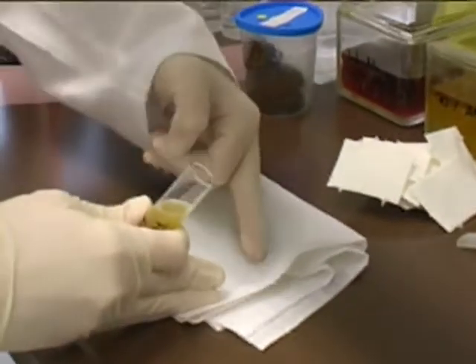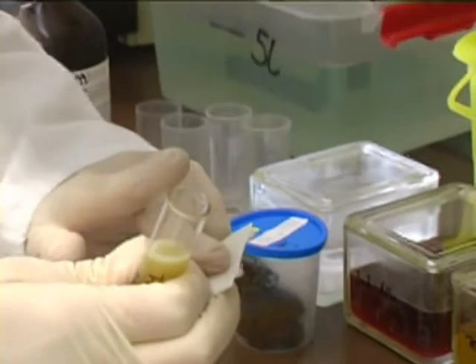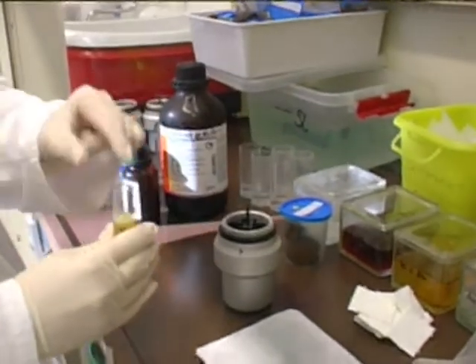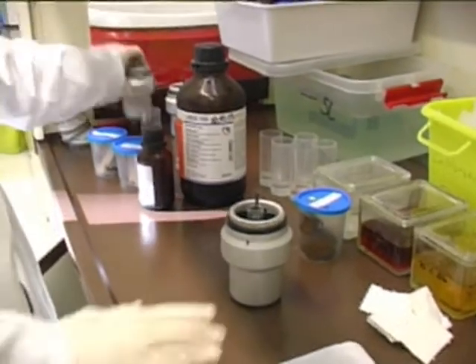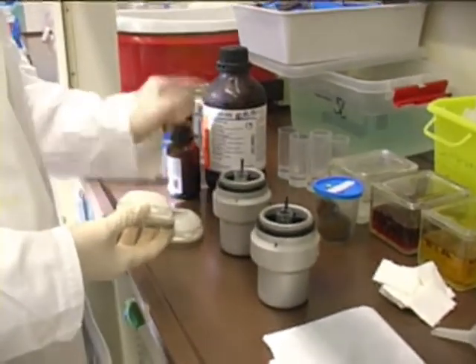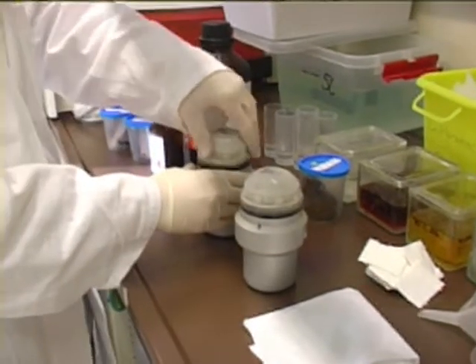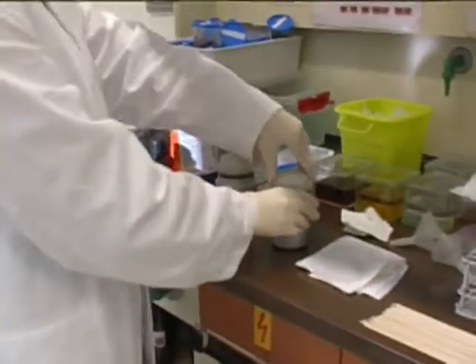And now I want to have this. Okay, good. Und das ist die Vorrichtung für die Zentrifuge. Also wir stellen es in die Zentrifuge. Das ist das Gegenstück, also ein leeres, da kann man auch einen anderen Stuhl nehmen. Genau. Und das wieder rausholen.